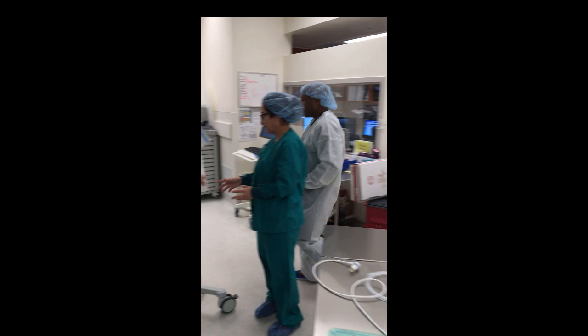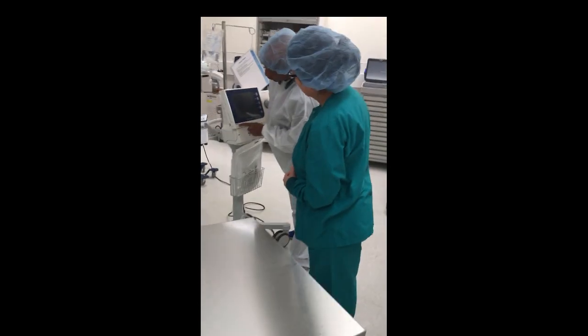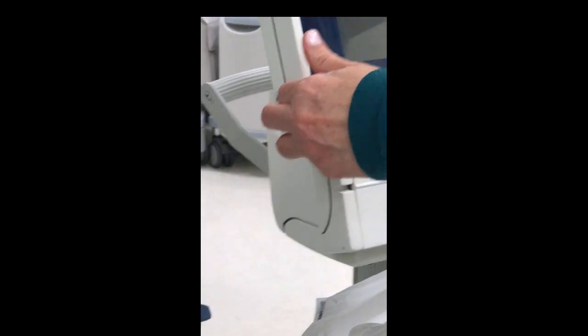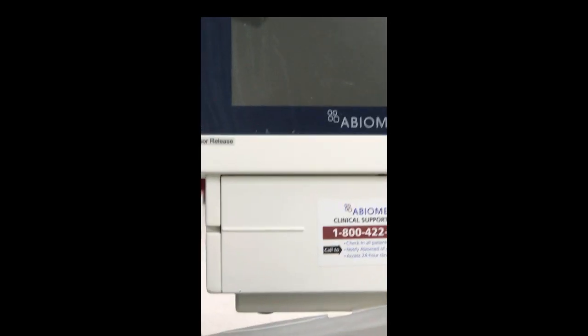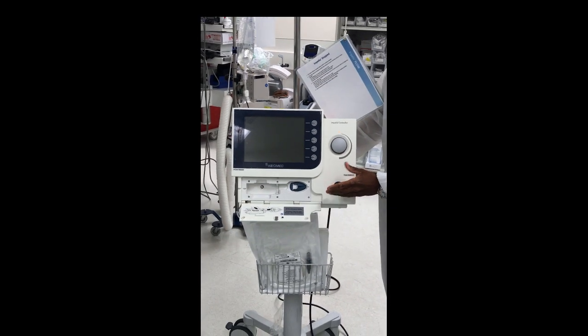Let me give you a quick overview. Cut it on. On this side, notice where it says 'door' — can you push that button right there? That opens up where the purge cassette is going to go. This is the device we're talking about right here.